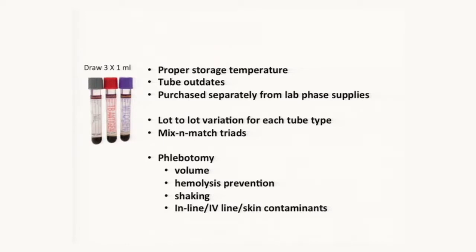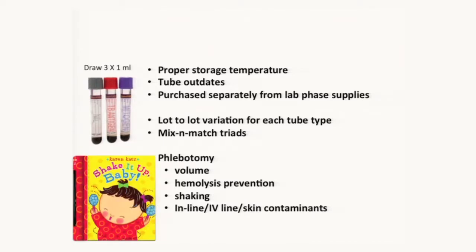And then the shaking, 10 karate chops has been what's sort of described. So if the phlebotomist, whoever is doing this, just sort of slowly draws the blood into the tube and lets it sit, the blood cells won't get mixed up with the peptides or mixed up with the mitogen, and you'll get a false negative reaction or a poor reaction.